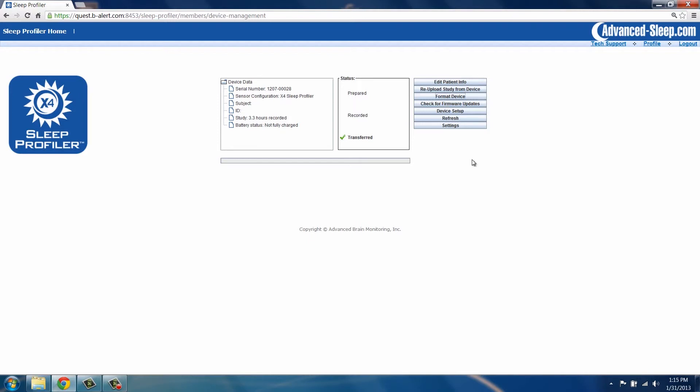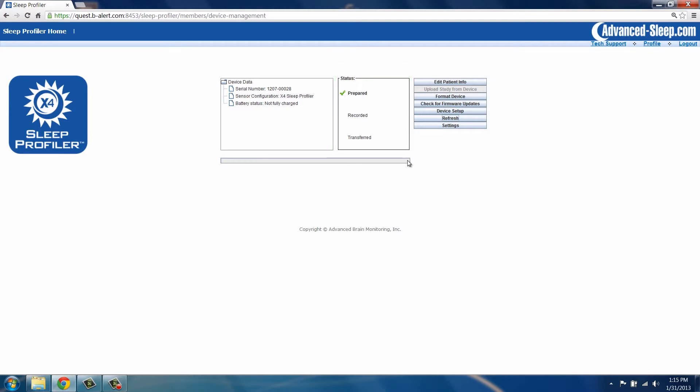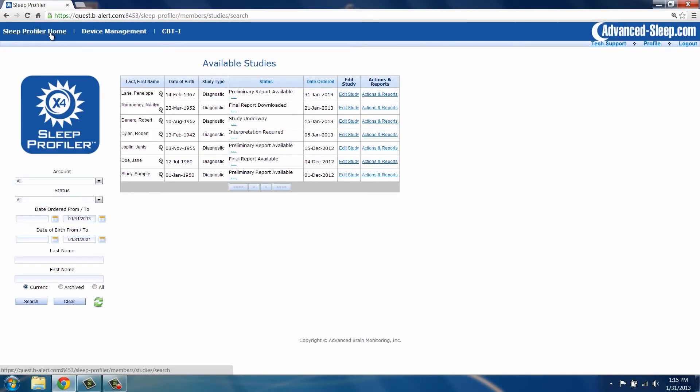Formatting is now complete. Note the status has changed to Prepared. The device is now ready for reuse and the next study can be initiated.